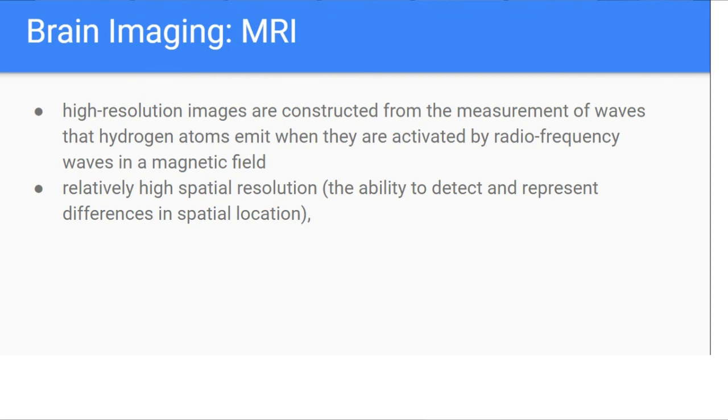And when we are measuring, the whole emission of waves across the brain gets recorded. Okay, and as a result of that, we obtain a particular kind of high resolution image, and through that we can differentiate, we can detect, we can segregate what kind of differences exist in different spatial locations. Okay, so this is the basic important technical process that we use in MRI.